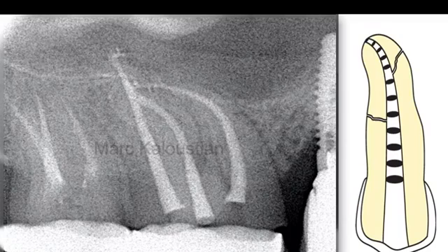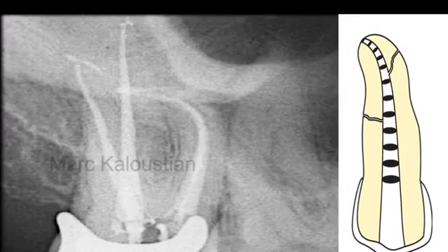If we have a flexible file, like the Endostar, for example, it is easy for us to go till the apical foramen without any problem in this kind of anatomy. Or it can be more difficult. What is difficult here is that after the curvature, we have 6, 7, 8 millimeters of canal. So we have to shape this part without doing something very important, not transporting the canal.